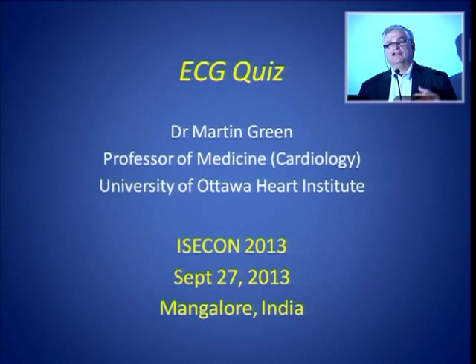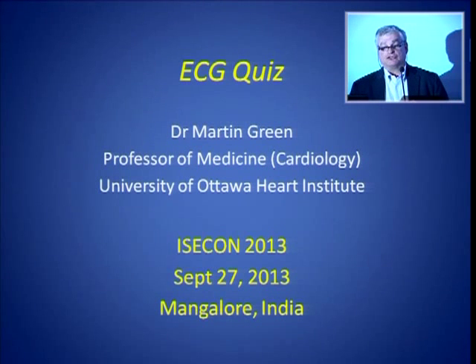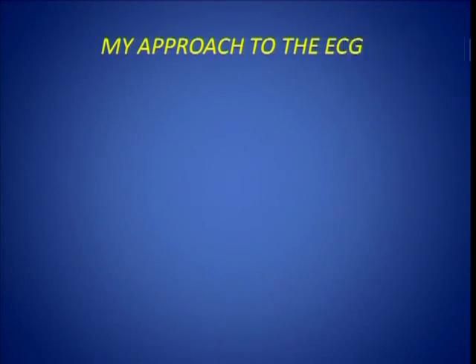As I see younger physicians, they don't even want to touch them. They feel that this is over my head. What I want to prove to you is it's not over your head. You have to have a method of looking at it, and when you do that, it works. So let's start off with my approach to the ECG.